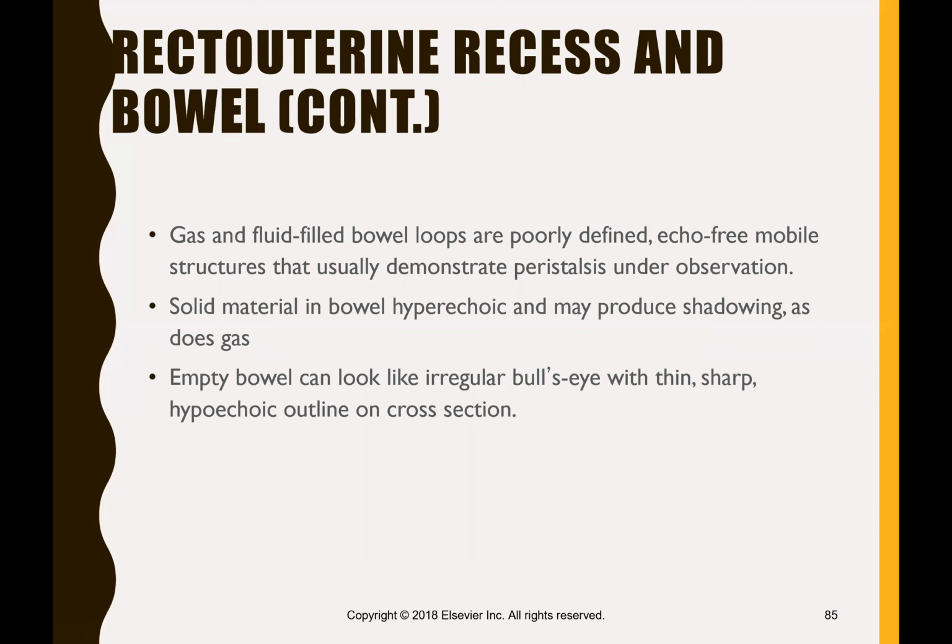You will also see some gas and fluid filled bowel while you're looking at this, and it sometimes is difficult to determine if this is bowel or if it's a mass. But one thing that we like to look at is peristalsis, which is movement of the bowel.